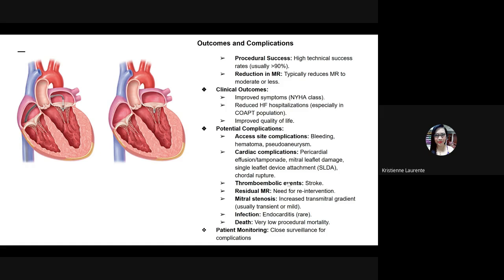Cardiac complications include pericardial effusion, tamponade, mitral leaflet damage, or even chordal rupture. Then there will be cases of thromboembolic events like stroke, residual MR which needs reintervention, mitral stenosis, increased transmitral gradient, usually transient or mild. It can also cause infection, which is rare, like endocarditis.